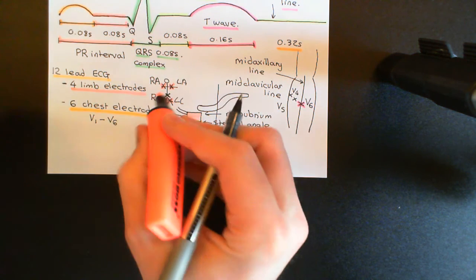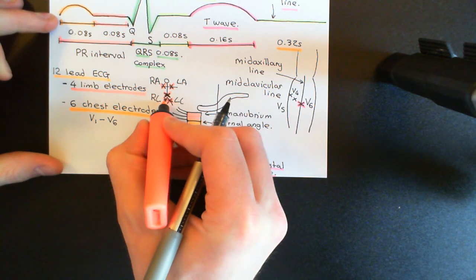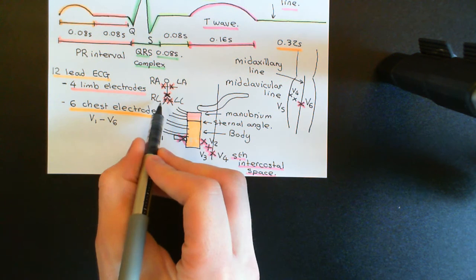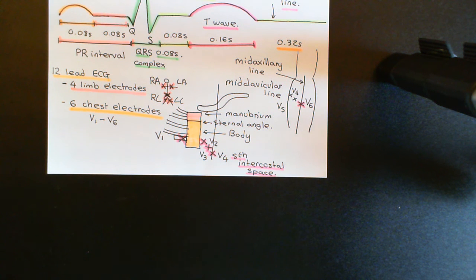So they pretty much both have the same electrical potential, and therefore there really is no point in using the right leg instead of the left leg. In fact, the right leg electrode is there for technical reasons. It's used for earthing processes, which must just be part of the electrical circuits for actually measuring electrical potential difference. Okay, it's there for technical reasons, is what I understand.